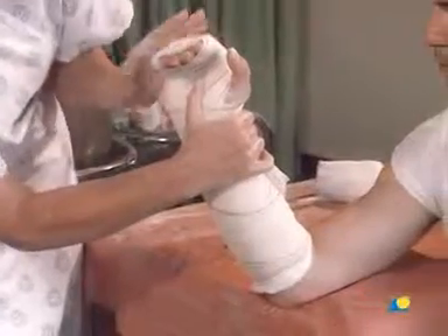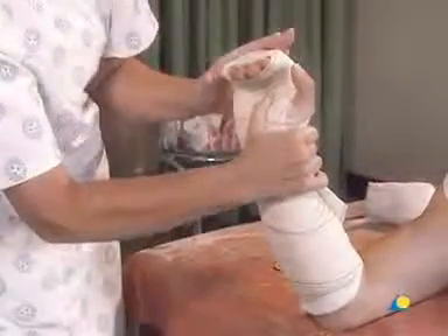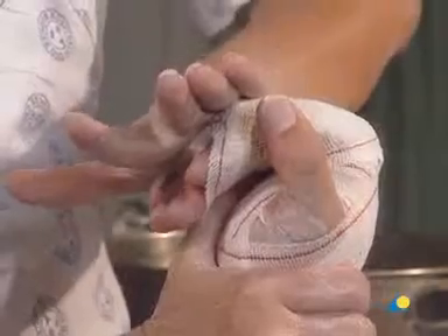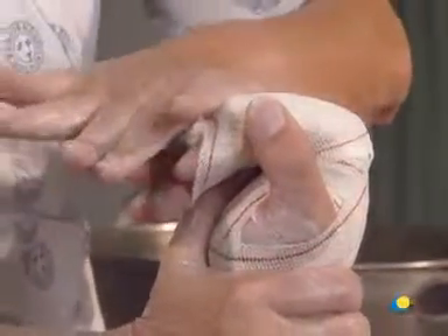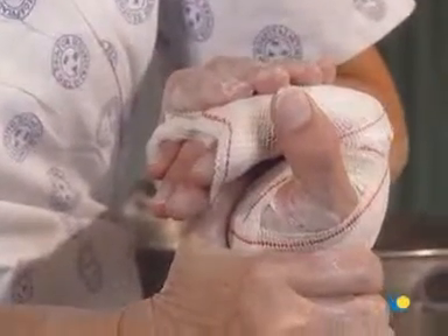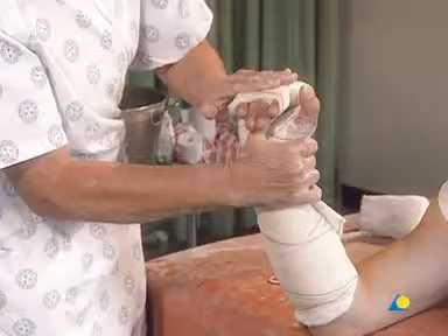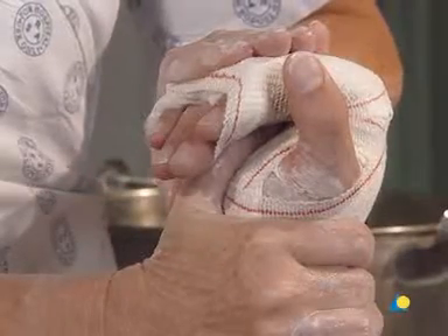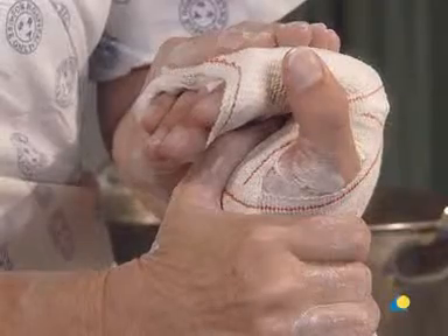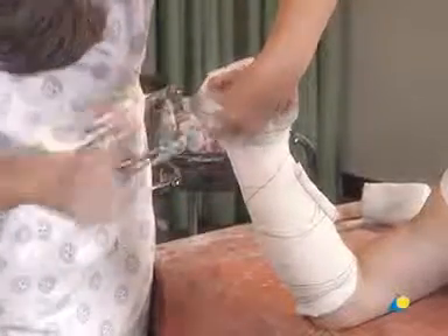Additional molding is applied by placing the thumb into the palm of the hand, the fingers around the wrist, and applying pressure to keep the wrist in extension. With the second hand, pressure is applied to the MP joints — this pressure must place the joints into a full flexion of 90 degrees. The pressure is maintained until the plaster has set; however, the plaster will not achieve full strength for 36 hours. The excess crepe bandage must be cut away to allow flexion of the fingers.